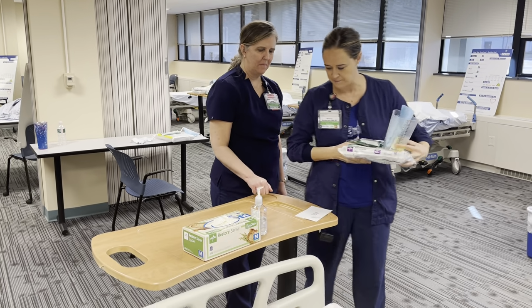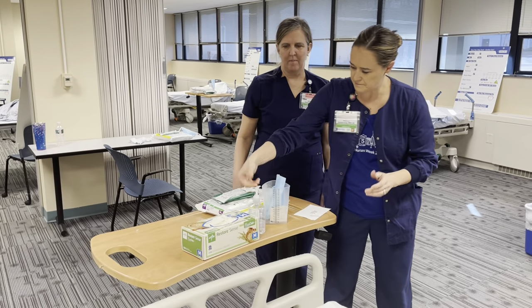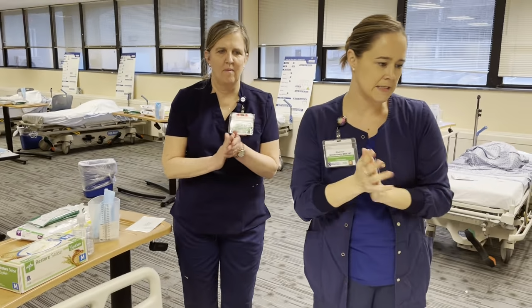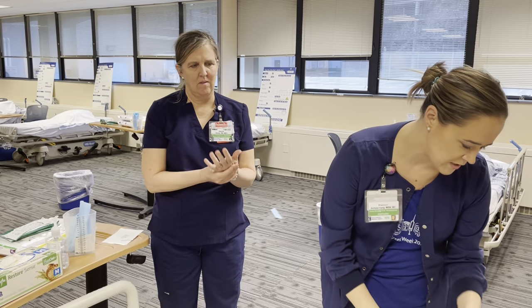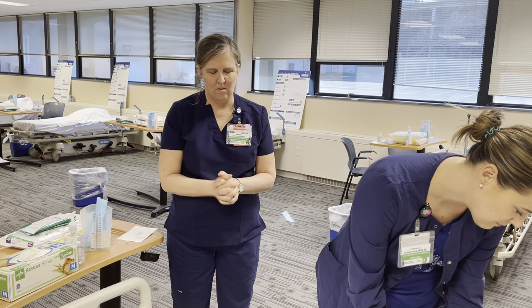Got my tech sheet. Come in. Hi, Mr. Gray. Hi, how are you? My name is Shannon. I'm one of the clin techs today. This is Janine. Hi, nice to meet you. May I check your armband, sir? Sure. Could you tell me your name and your date of birth? It's Jean Gray, December 1st, 1964.